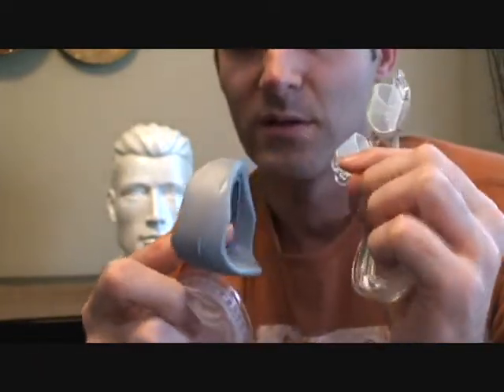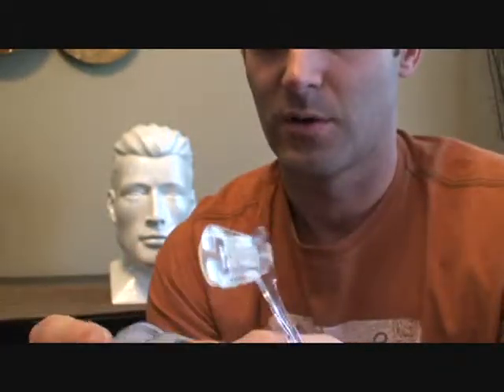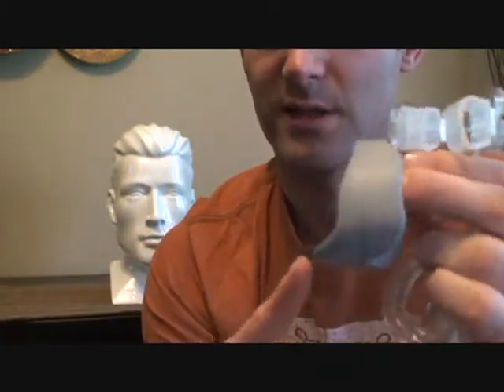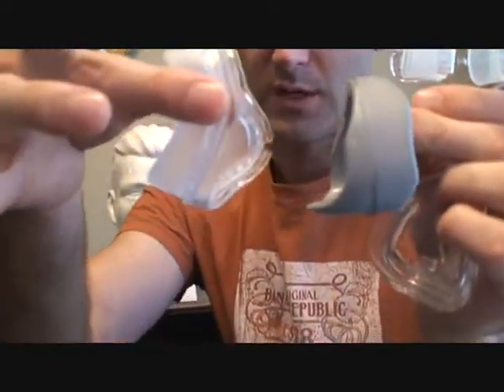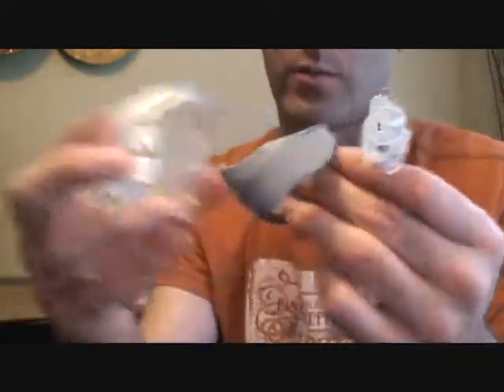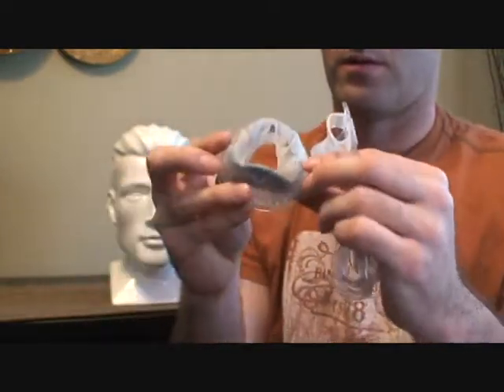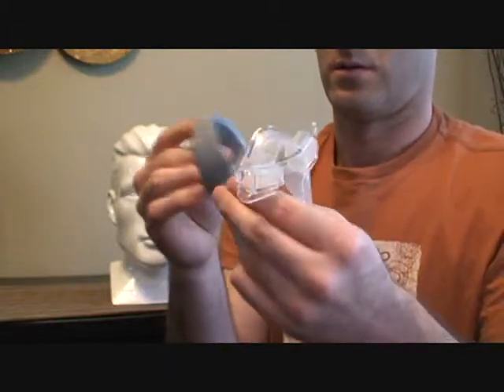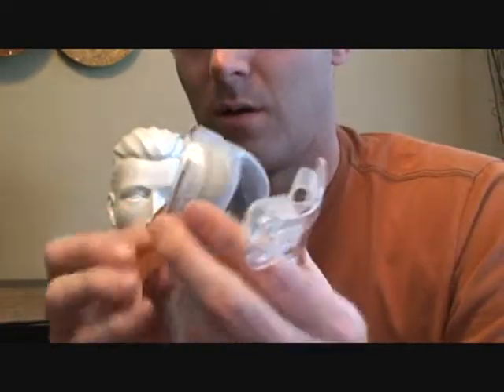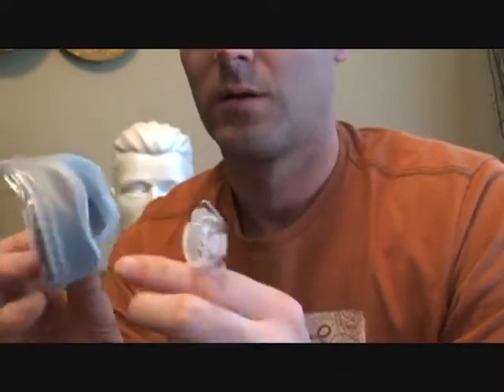You can see how this is a little oblong here. So the way it fits is the longer part fits in here. The shallow part with the groove here is what touches your face, not this side that sticks out far. So when you're putting it in, you can see how this is designed to fill out the bottom part of the thinner membrane here. So you see how this touches.